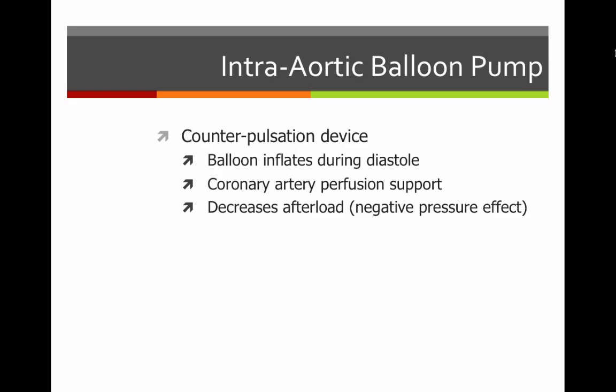So during diastole, the balloon in the aorta will inflate and push blood into the coronary arteries, providing oxygenation and perfusion to the heart. And then also, on top of that, it's going to decrease afterload, because as it deflates during systole, it's going to create this negative pressure effect. It's going to kind of suck a little bit of blood into the aorta and to the body through that mechanism.